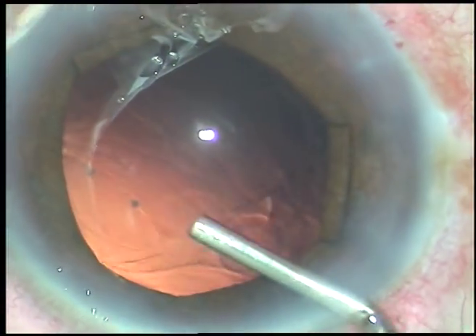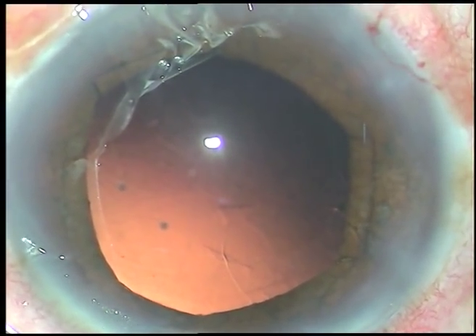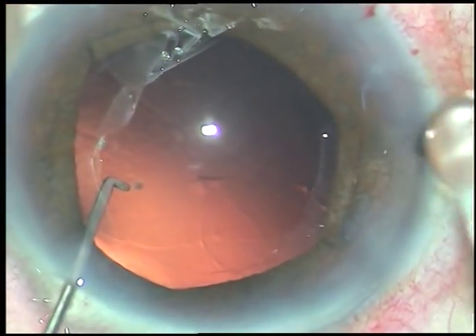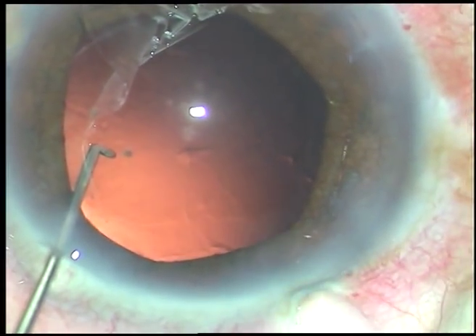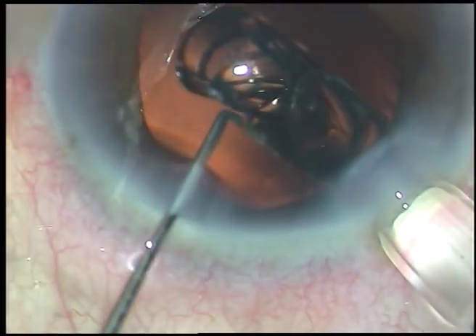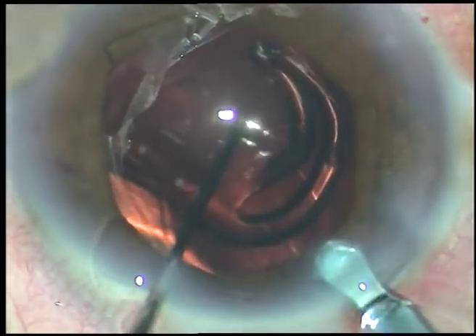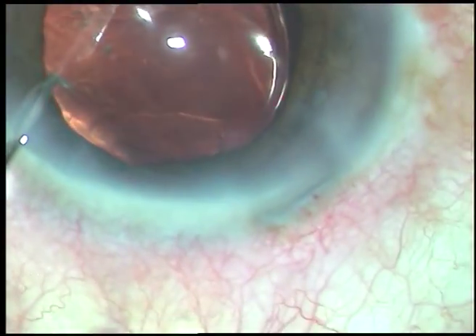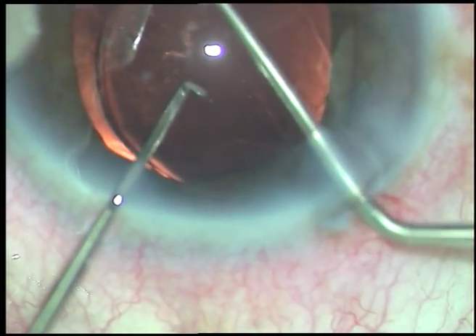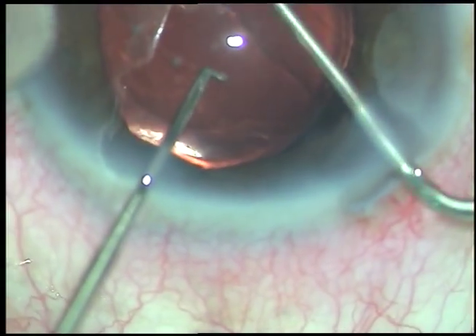Now I inject viscoelastic substance and implant a hydrophilic acrylic foldable intraocular lens in the capsular bag. The lens goes into the capsular bag. Now I dial the lens and place the haptics at 2 o'clock and 8 o'clock position.